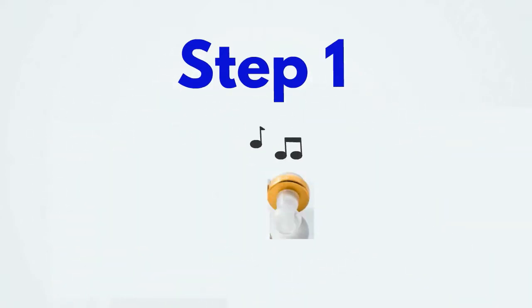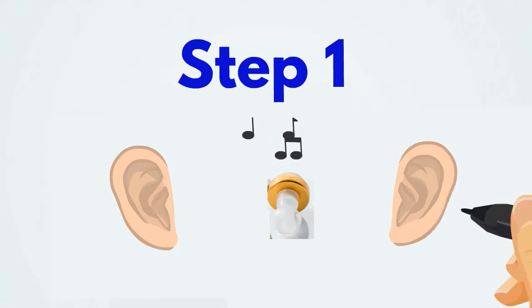Step 1: Adjusting the sound tube. The sound tube can be adjusted for your left ear or your right ear.